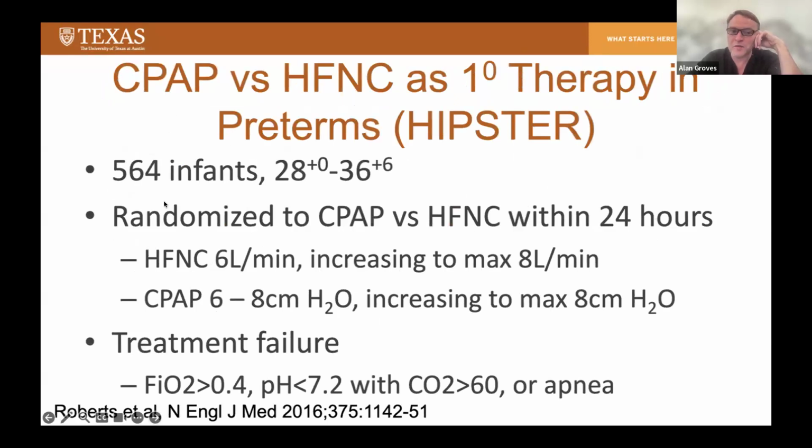Here's HIPSTER, a wonderful, wonderful study, 564 babies. You had to be 28 weeks to enter the study. You had to be preterm to enter the study. They randomized to either CPAP or high flow within 24 hours of birth. And I really want to focus on how much flow rate they started on. They started in these small babies on 6 liters per minute and increased to up to 8 liters per minute on high flow before saying that the babies had failed that therapy. CPAP, they started at a pressure of 6 and went up to a pressure of 8, with a max CPAP pressure of 8 centimeters of water.